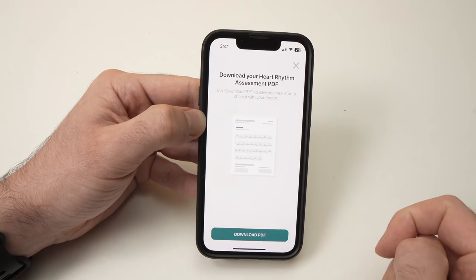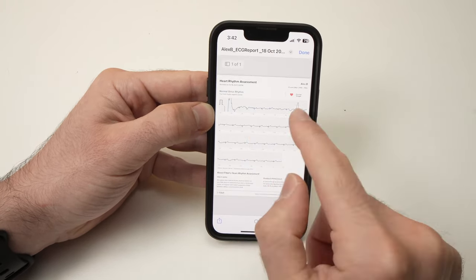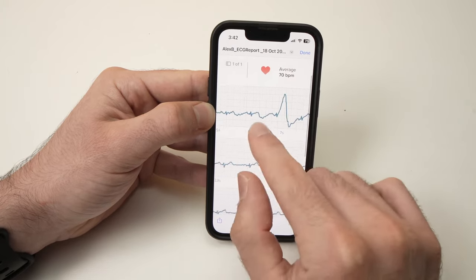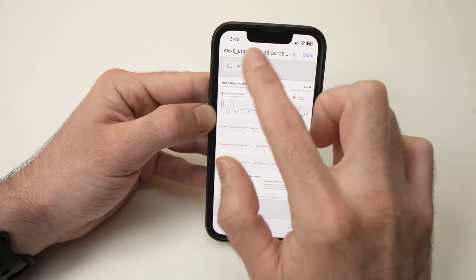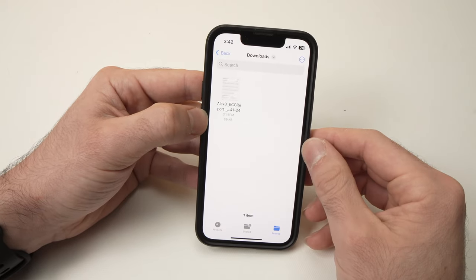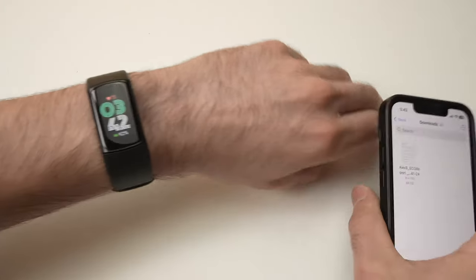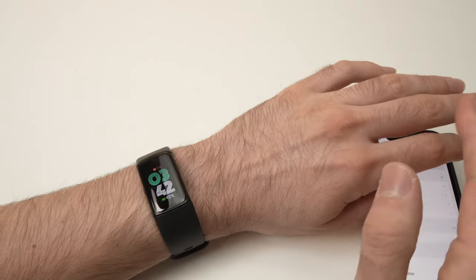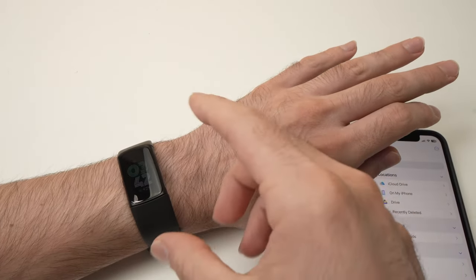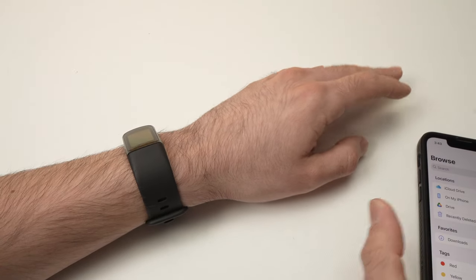Here are the saved results — tap on it to see the ECG reading. This PDF format is easy to share via email or however you communicate documents with your healthcare provider. By the way, you don't need a Fitbit Premium subscription to access this feature — you can get the results I just showed you without paying a monthly fee.